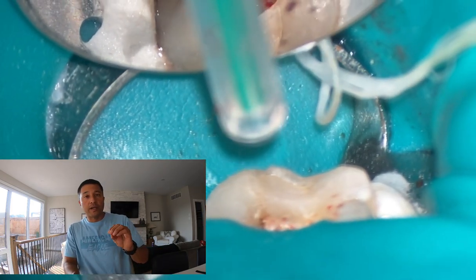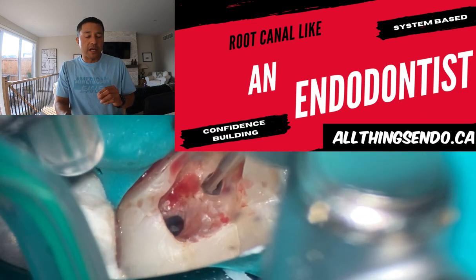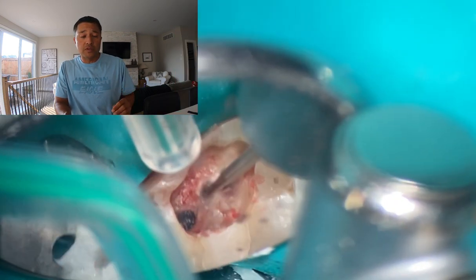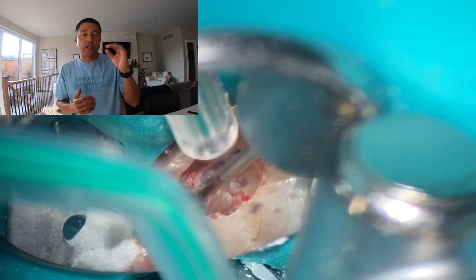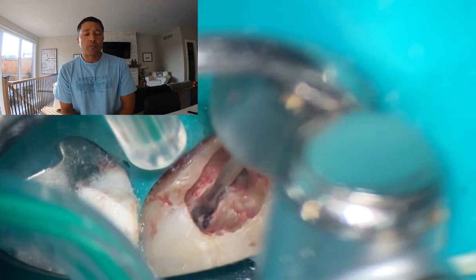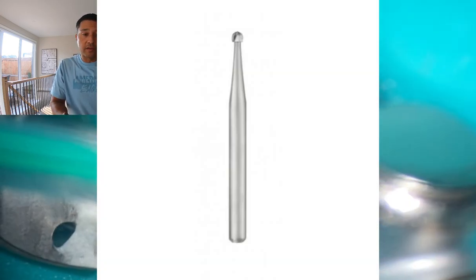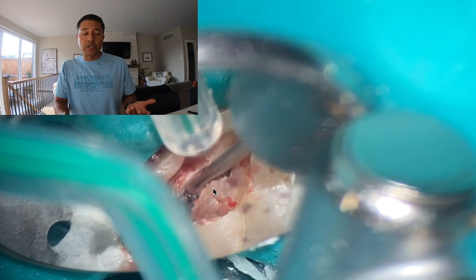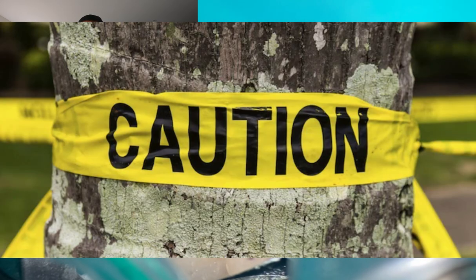I didn't take a bite wing radiograph. I feel cautious, not just confident. I have a feeling I'm just going to slightly take that round bur and just unroof that. Sure enough, it looks like we're unroofing some more pulp chamber. What was going through my mind was that it's equidistant — equal height to the level of the gingival portion of that box. I don't think we're perforated, and I'm using the measurements, especially when I go straight in. You can also use your long shank bur. From the mesial buccal cusp to the roof of the pulp chamber is roughly six millimeters, and this does not look like it's more than six millimeters. So I was fairly confident, still cautious, that I could unroof that just with my Munce bur.